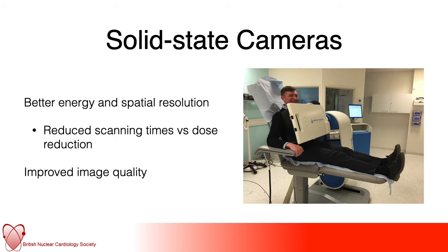The other thing you can do is you can get a better camera, and I'm glad to say as technology's improved we have done just that. This is an example here. You can see this is my colleague Steve White. I warned you he was going to be featuring in one of the pictures, and this is a cardiac-only CZT or solid state camera, so cadmium zinc telluride is CZT.